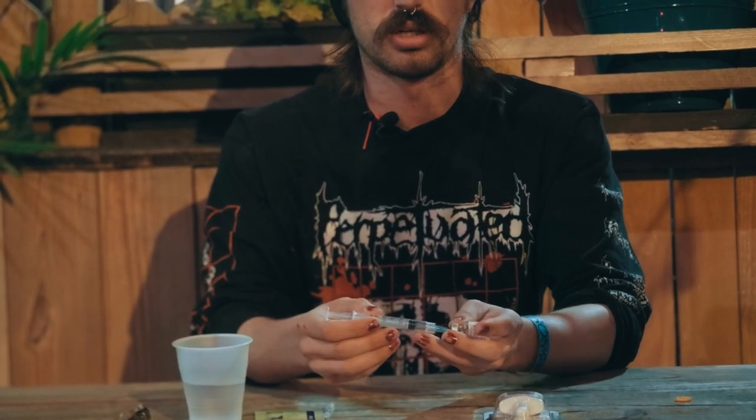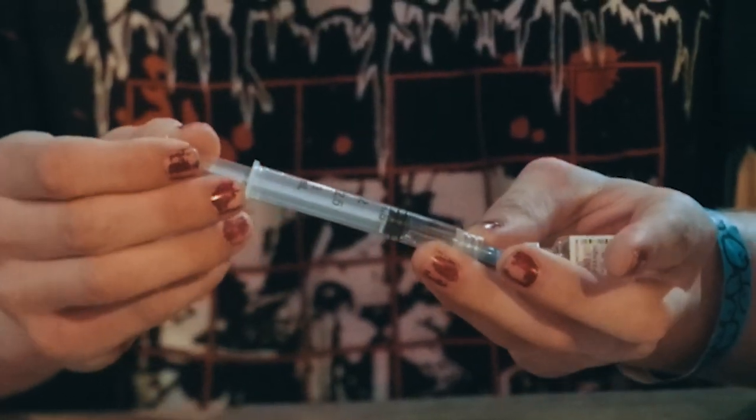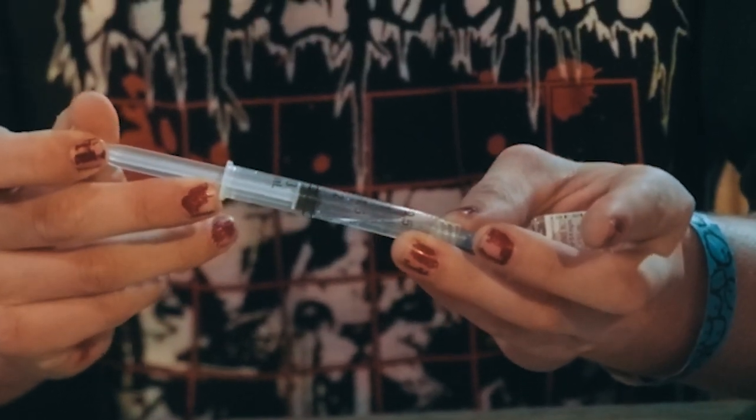Before you do so, pull out a little bit of the plunger to leave some air. The whole vial is one dose, so when you're drawing it, pull the whole vial into the syringe. Now the syringe is completely full. The next step is injecting the person. Traditionally, you want to get them at a 90-degree angle in their deltoid — where you got your COVID vaccine or flu shot. Any fleshy muscular part of the body also works fine, such as the thigh or the butt cheek.